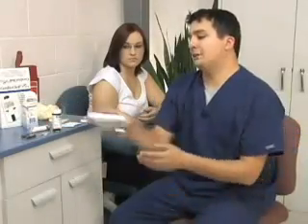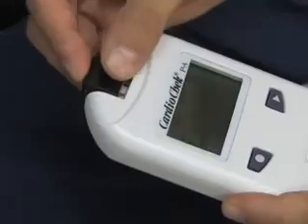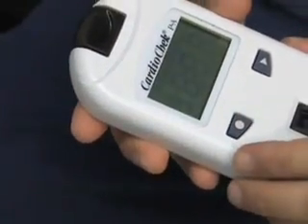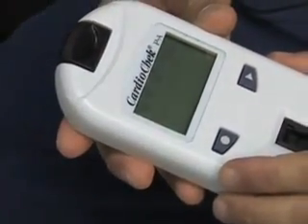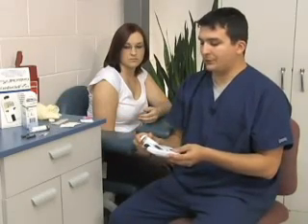In order to perform a patient test, simply take the analyzer, insert the memo chip into the top, and then press any button to turn it on. Once the instrument turns on it will display the date, time, and briefly display a lot number of the test strips to be used.